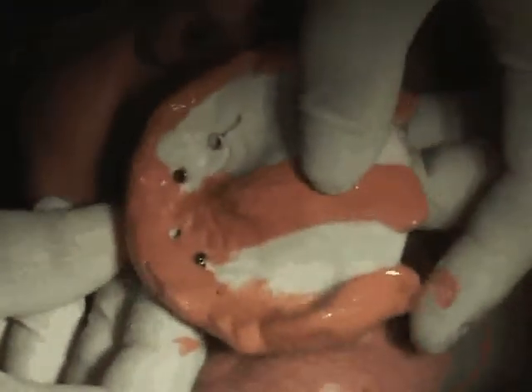To remove this material, don't use the handle as a handle, but just take your fingers up under here and then just kind of work it out until you hear the suction release. And as soon as the suction releases, then it comes out. And see, the bar came out with the impression.